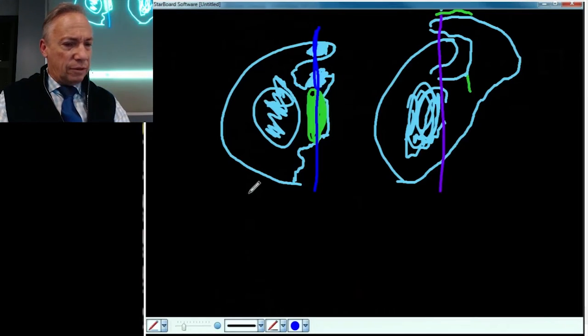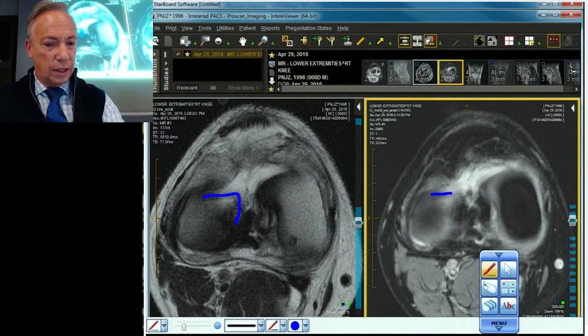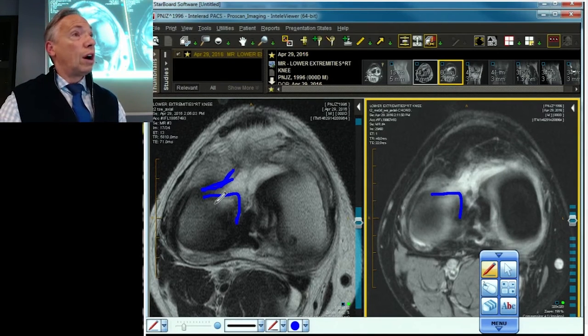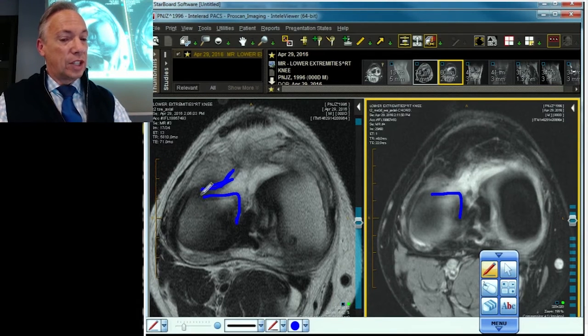What you're looking at are the native meniscus and a displaced piece of meniscus that has broken off, with a gigantic gap in the center.